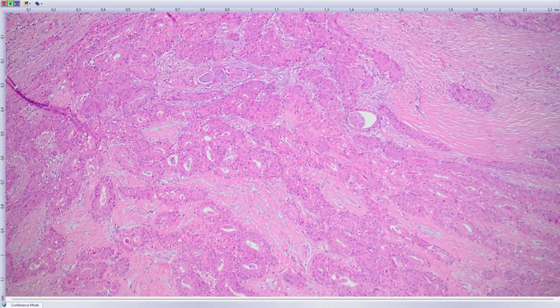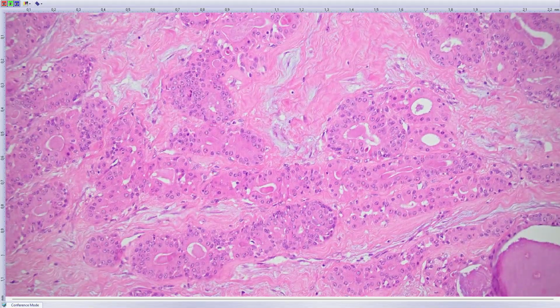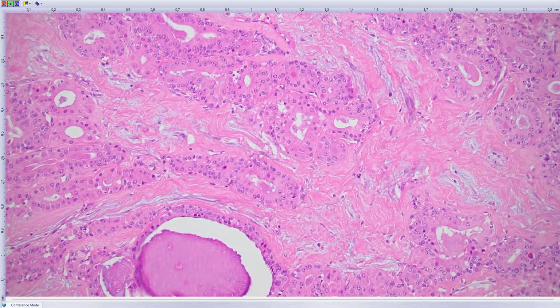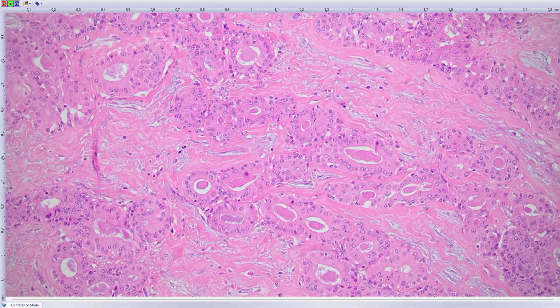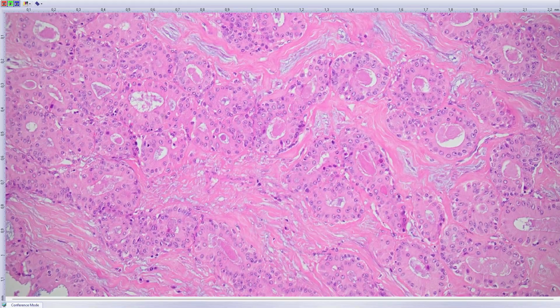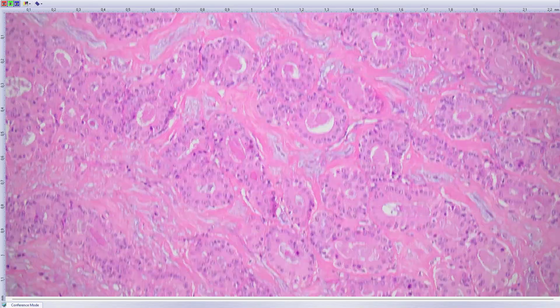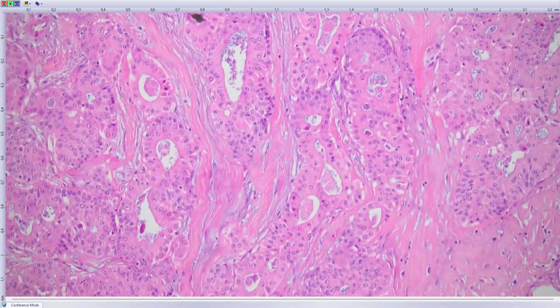Now we can have a look at the morphology. So it's a pink tumor. You can see that the cytoplasm is relatively abundant. We may start to think about Warthin tumor, but maybe not very well, or it's very bland looking. The cells are relatively regular with nuclei with one distinctive nucleoli. So could it be adenocarcinoma not otherwise specified? I did not want to end with this.